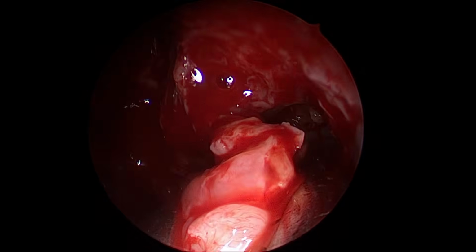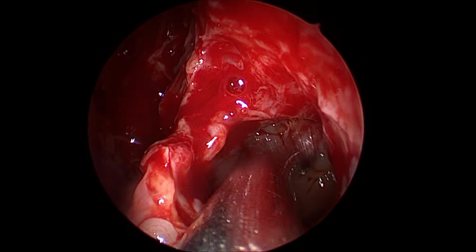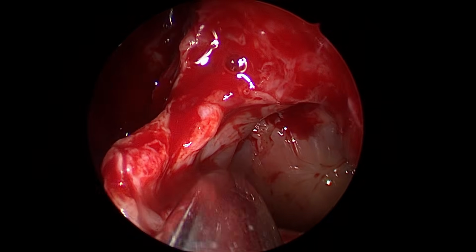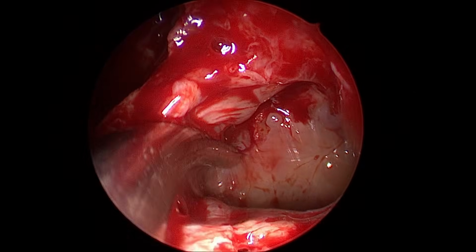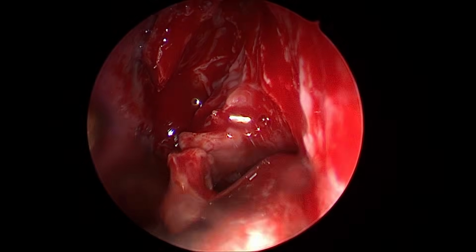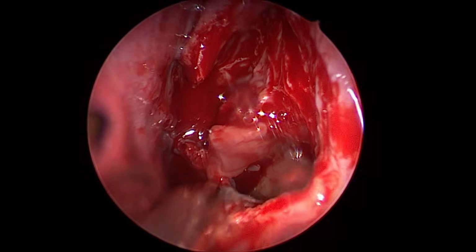Don't be aggressive on the mucosa. Even this cobblestone appearing mucosa is likely to revert once the ventilation drainage is established and the topical steroids start going inside. See this? I am never going to be aggressive on the mucosa. Paranasal mucosa is the key. Sinus mucosa is the key.